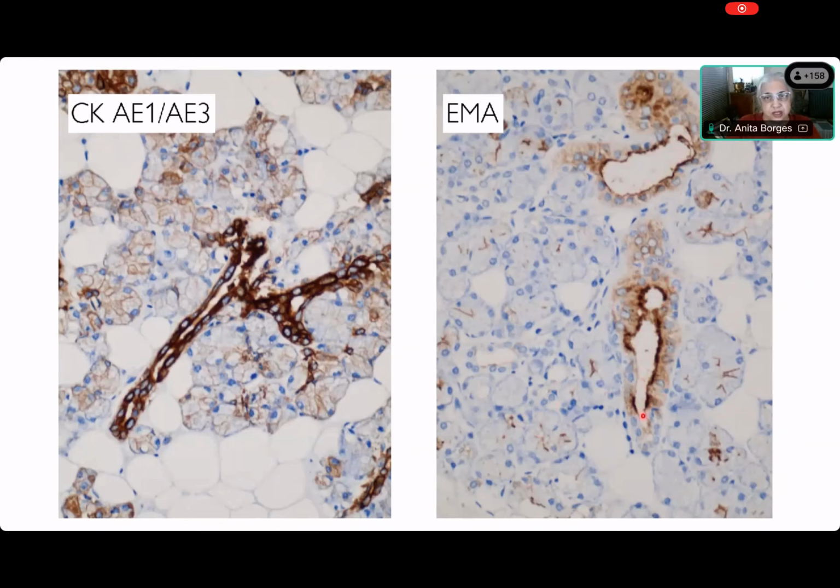This thing where my cursor is, and maybe I should get my laser pointer, this little duct over here, which you can hardly see, is the intercalated duct. And in the intercalated duct, you can't see the myoepithelial cells. You really have to have extremely thin sections, and you should be looking for it. So you can't see myoepithelial cells, just like Cinderella, who's here in the top left-hand corner scrubbing the floors. She was unnoticed. Okay, that's essentially the case.